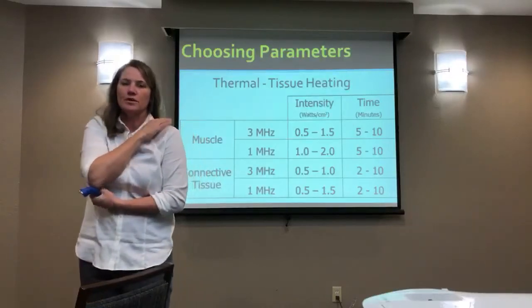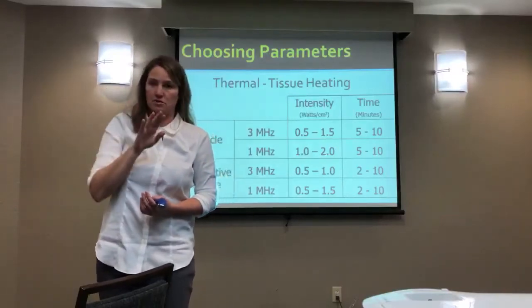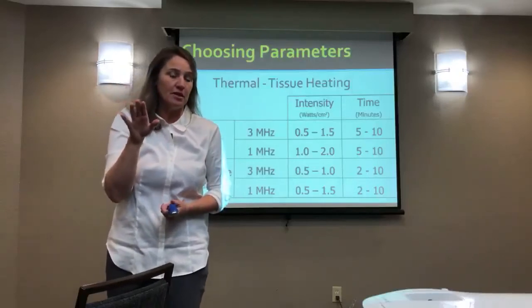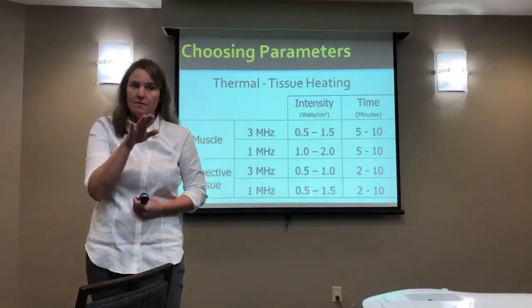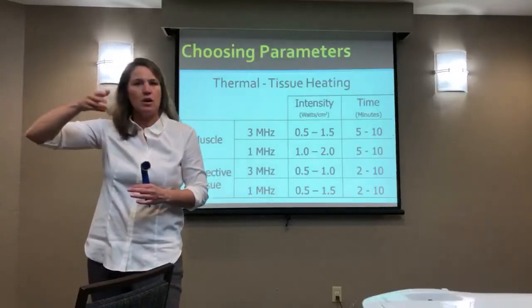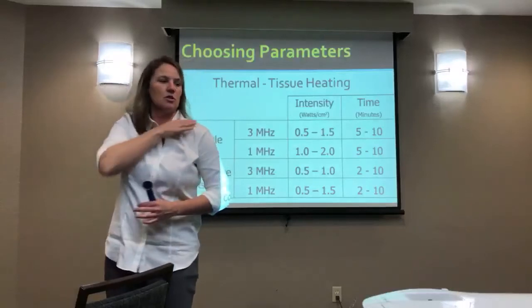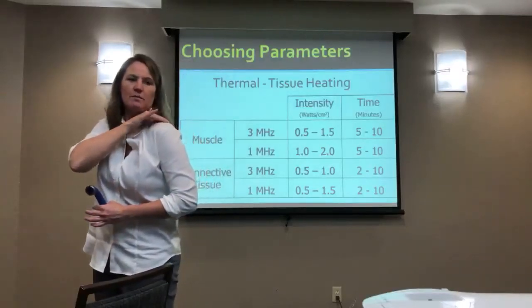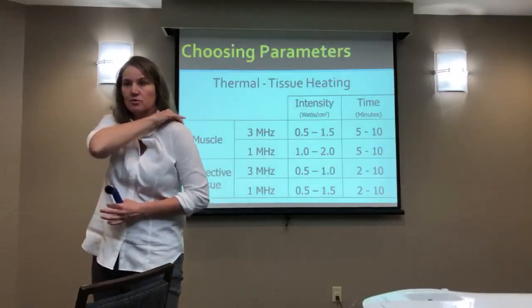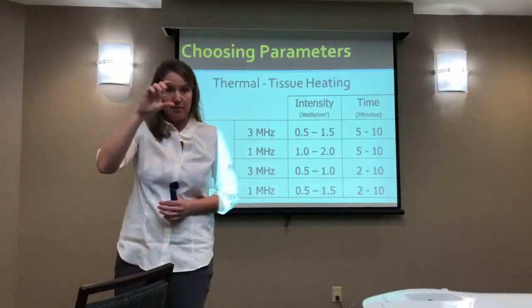So that's where, when we talk about the shape, do you go linear, do you go round? I'm going to do it over the shape that makes sense for the treatment area. So from a thermal perspective, if my target is extremely variable, my outcome is going to be risky and not predictable. So I would target by moving in a way that mimics, if it's this muscle, maybe a fan shape or a teardrop shape, something that's going to mimic the area that's depth.